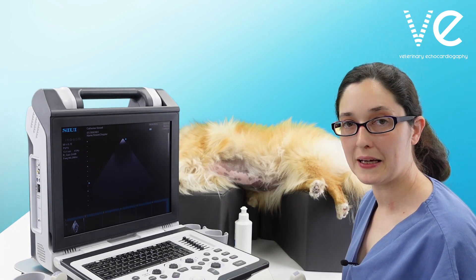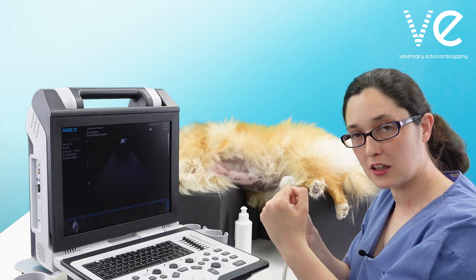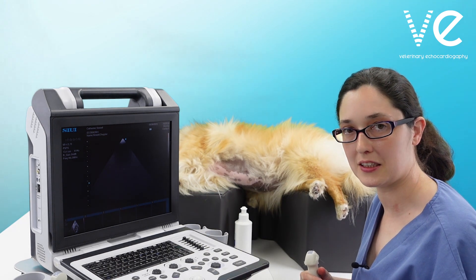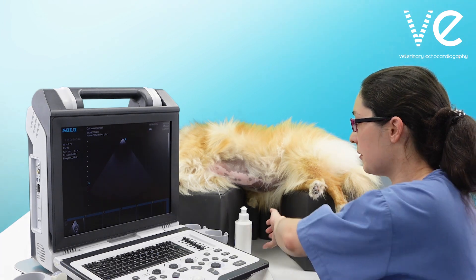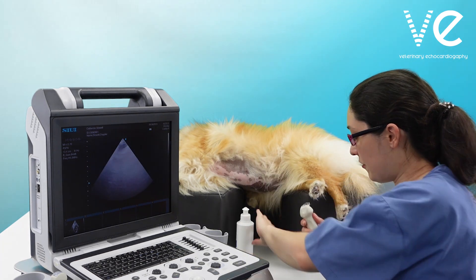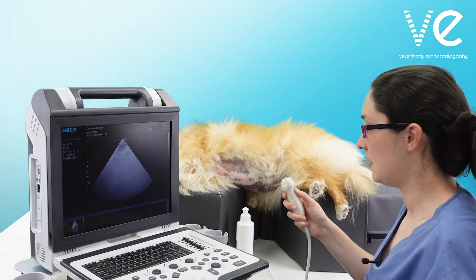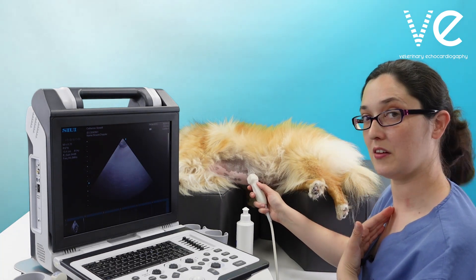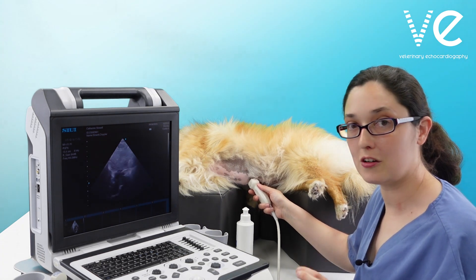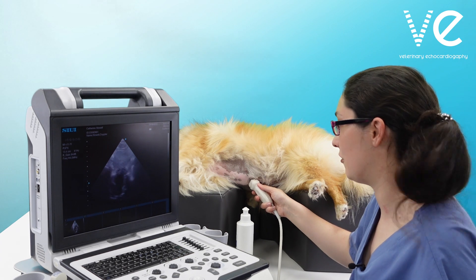If you have somebody to hold the patient, it's good to get them to crunch their legs together a little bit just to soften those abdominal muscles so that you get a better chance of a good view. I have the marker with my thumb on it and I'm putting the marker towards myself. It doesn't matter so much in this view if you do it the other way around — the priority here is just getting the aortic valve.